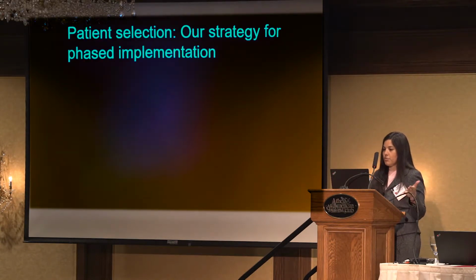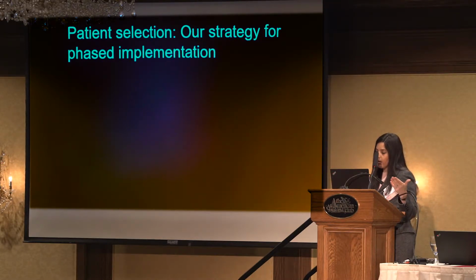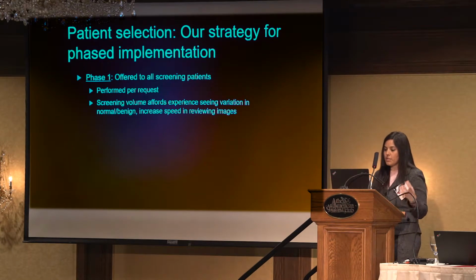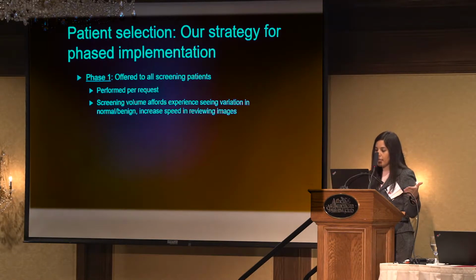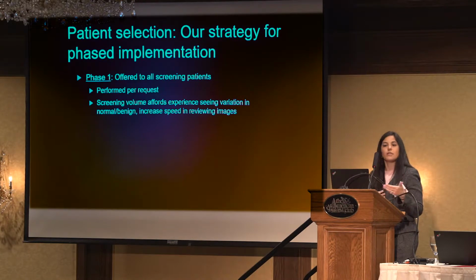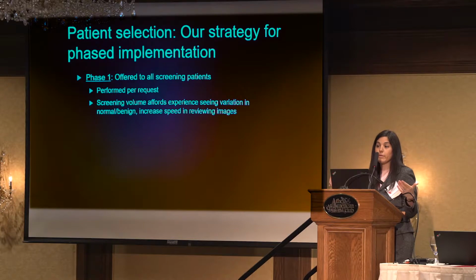So how did we choose? We have so many options of how to stratify patients. At our institution, we did have to do a phased rollout, so we felt that with a limited resource, screening mammography would maximize the number of patients who could benefit from the technology because it takes less time than a diagnostic exam. And in addition, the benefit of the reduced recall rate is really only seen in the screening population because our diagnostic patients stay until the completion of their appointment.